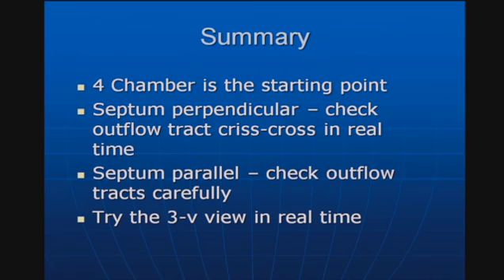If that septum is perpendicular to the ultrasound beam, it's very easy to see the outflow tracts crisscross. If it's parallel, you have to check the outflow tracts very carefully, and you should try this three-vessel view in real time. If you have any questions, press the help button. Ask for somebody else's help.